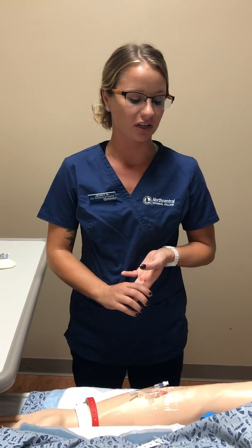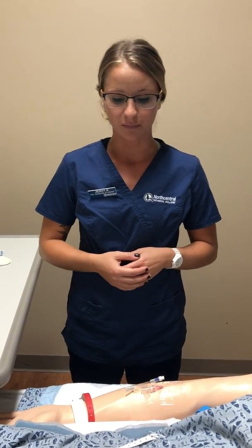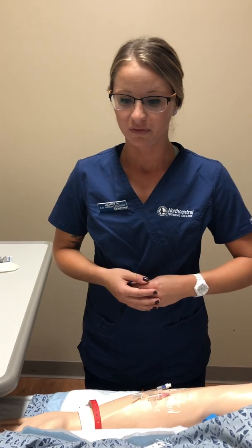I'm going to leave the room, and I'm going to chart and document what just occurred: the date, the time, the gauge and type of needle that was inserted, how the patient tolerated it, and that it was done in 1 attempt, so the number of attempts, and any solutions that were used, and in this case it was normal saline, and that concludes this.